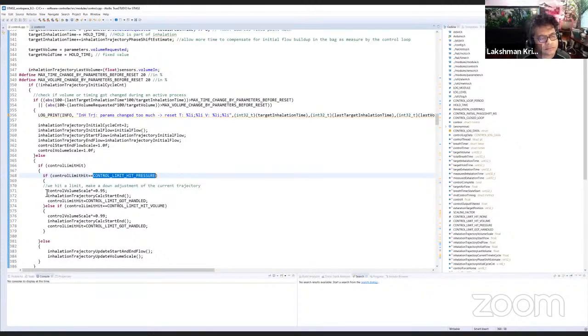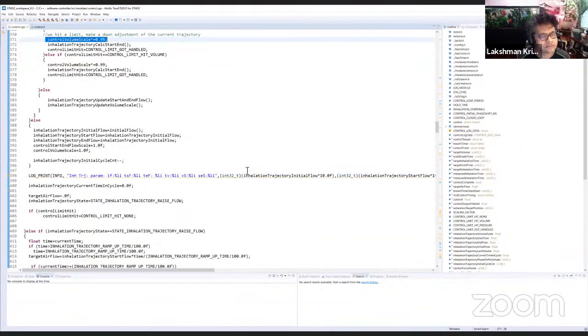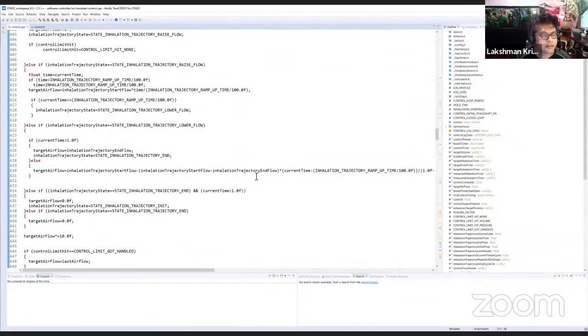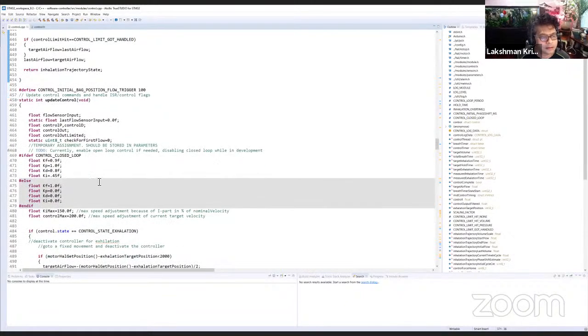So here's the backup on the control volume, so that you never exceed one of the parameters you've set. Obviously, things like parameters and so on are hand tuned.